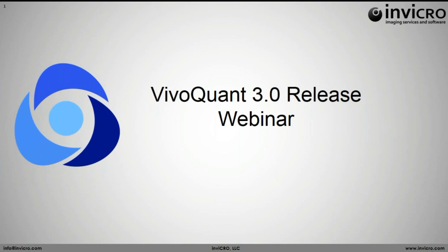So today I'm going to start off taking you through some slides just briefly on the background of InVicro, a quick overview of who we are and what we do. Then I'll introduce some of the features and tools that we'll be reviewing in the software, and then wrap up naturally with a review of the software itself, going through the new features and of course highlighting some of the old features as well.